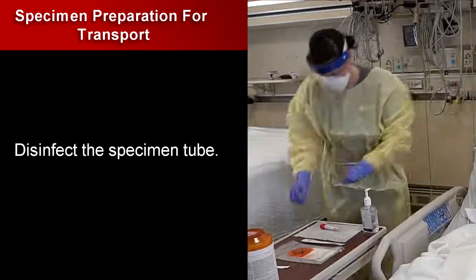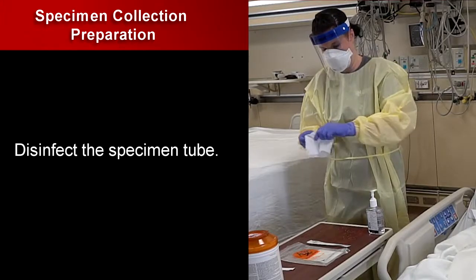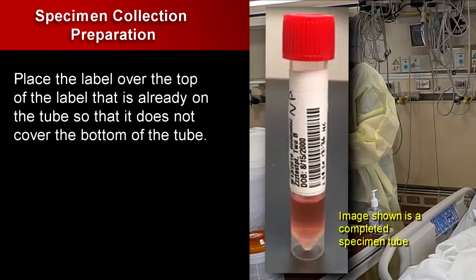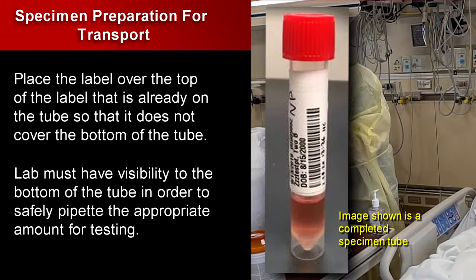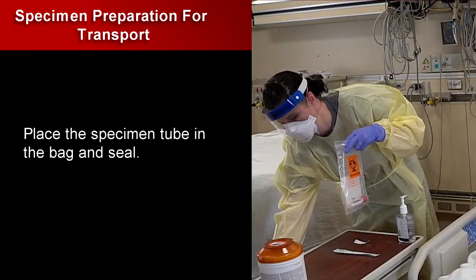Disinfect the specimen tube with the disinfectant wipe that is laid out on the table. Place the label over the top of the label that is already on the tube so that it does not cover the bottom of the tube. Lab must have visibility to the bottom of the tube in order to safely pipette the appropriate amount of testing. Place the tube in the specimen bag and seal.